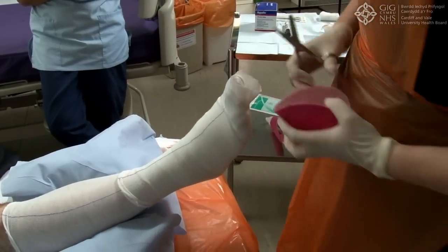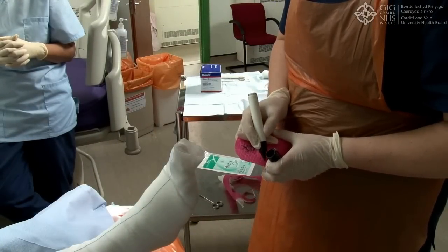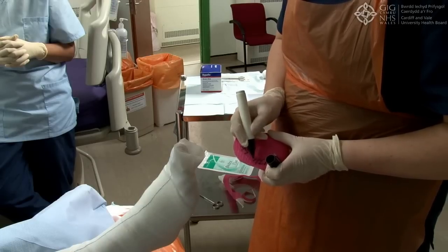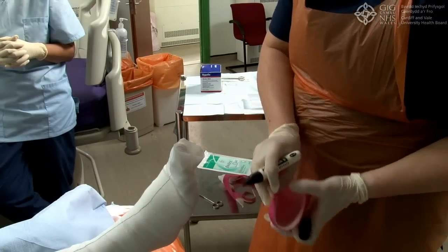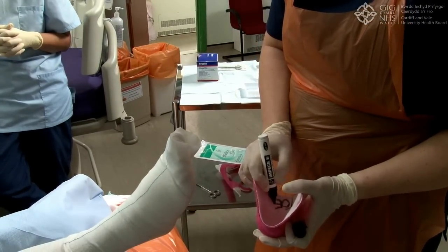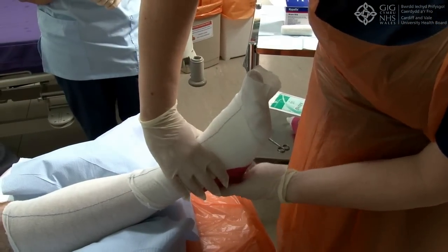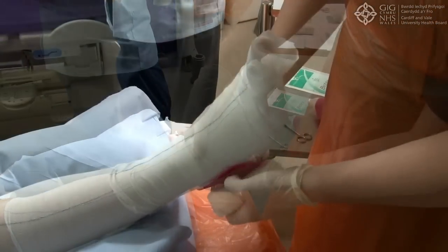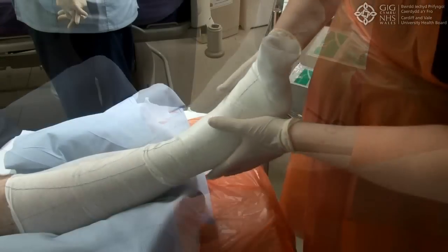Re-inspect the cast. Mark the cast with either left or right foot, the date it was made, your initials, the name of the patient, and heel and toes to ensure the cast is always put on the right way. Ensure a snug fit. Apply bandage over the cast to hold in place and secure with tape.